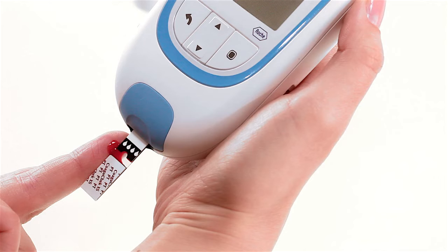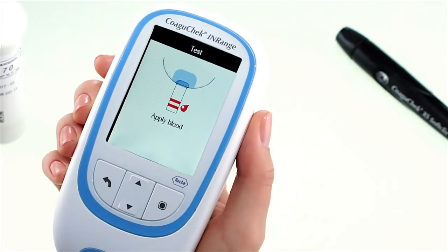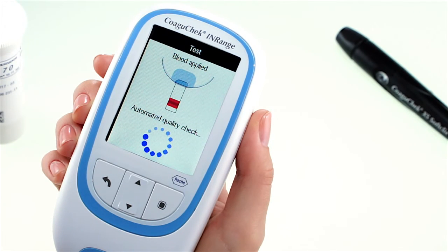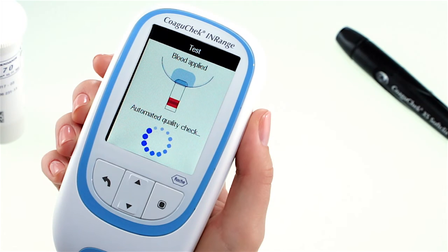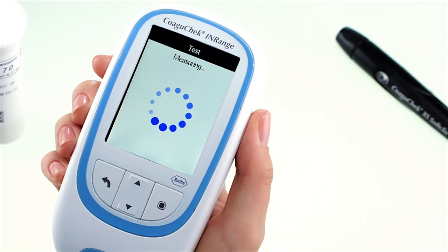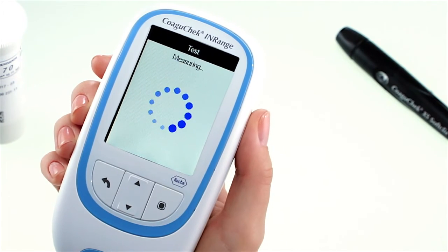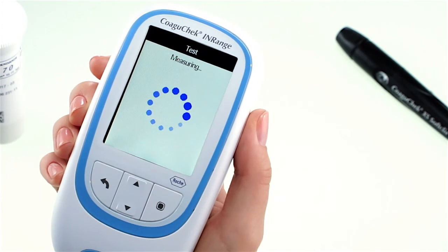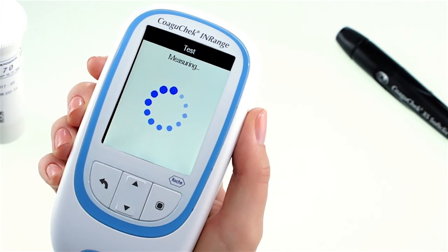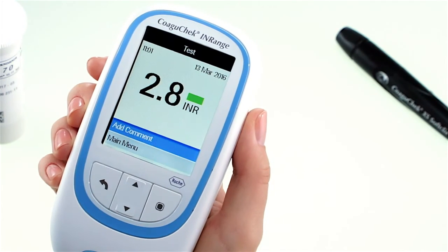Applying blood after this time period may cause an inaccurate result, as the blood may have already started to clot. When enough blood has filled the strip, the meter will let you know by beeping. The blood drop symbol disappears and the test starts. Do not touch the test strip until the result is displayed. In the background, the meter performs an automatic quality control check of the test strip, and the coagulation measurement starts. The circular indicator lets you know when the meter has determined the result, which is then displayed.